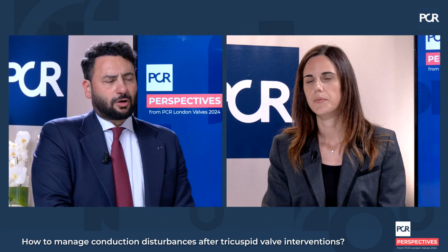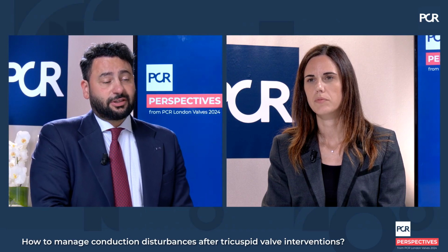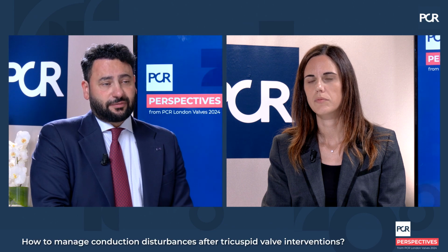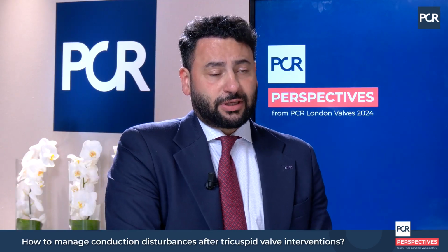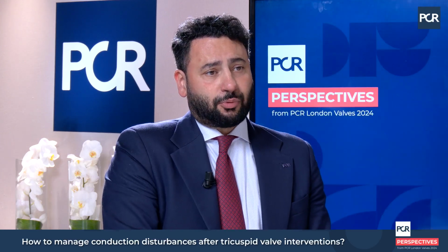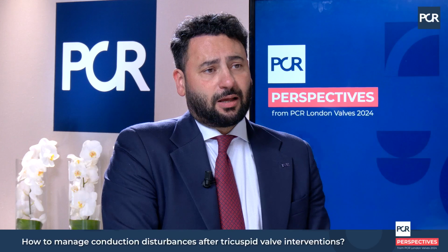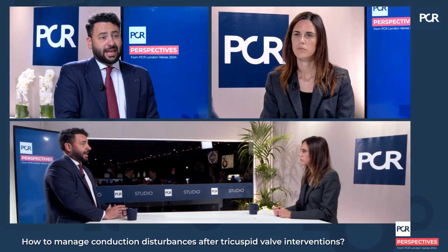Can we use some parameters to predict this situation? Even though it's an important feature, TTVR is a novel strategy for treating patients. We still don't have a lot of data to find predictors, but the only study that has focused on that found that the presence of left bundle branch block or fascicular block were the only predictors for AV block after the implantation. So probably those patients should be monitored more carefully.